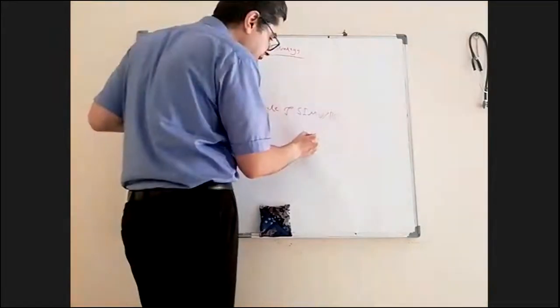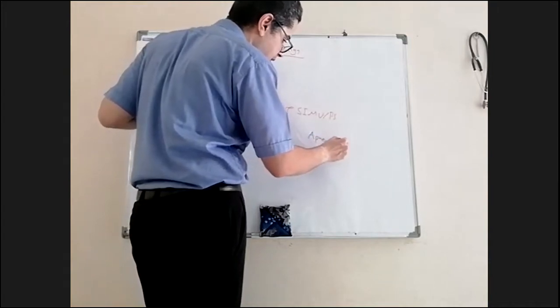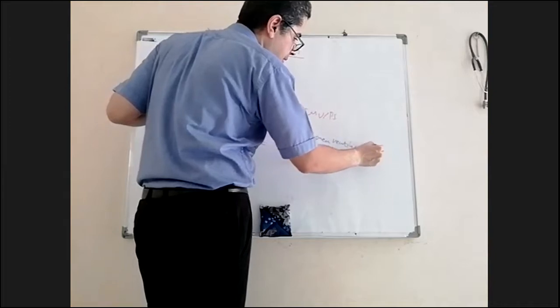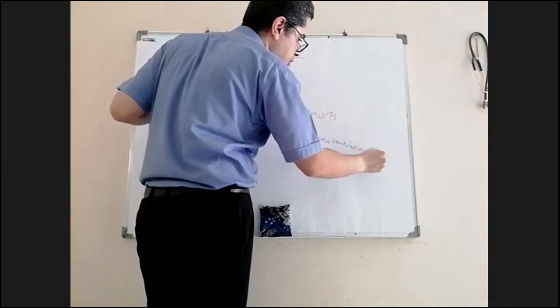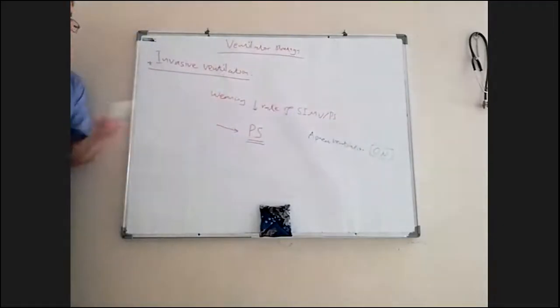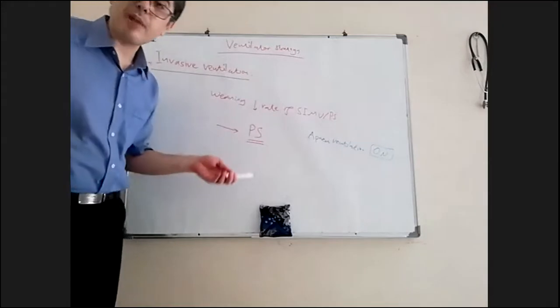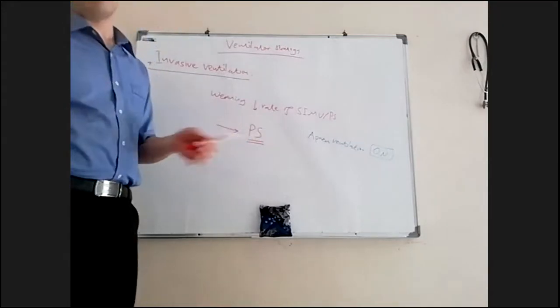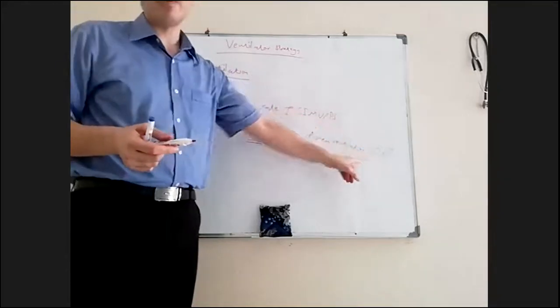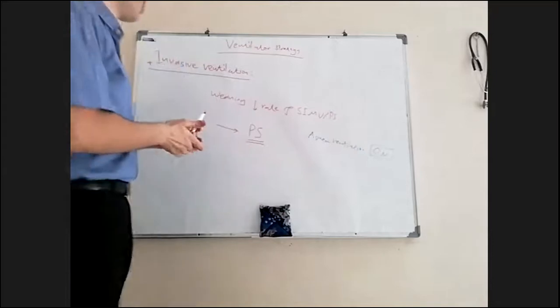Don't forget apnea ventilation. This is apnea ventilation, it must be on. So this is very important. We shouldn't forget. Otherwise, you cut down the rate, you keep the pressure support, and the patient goes to apnea, and he will suffer from this apnea. Because if your apnea ventilation is off, it will not work. So be sure your apnea ventilation is on.